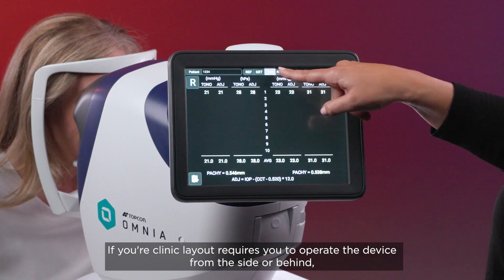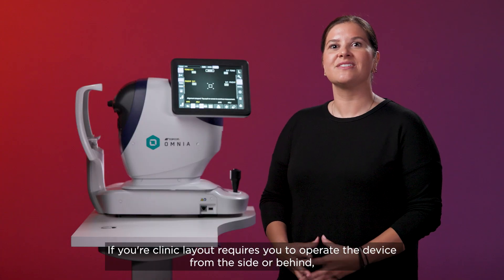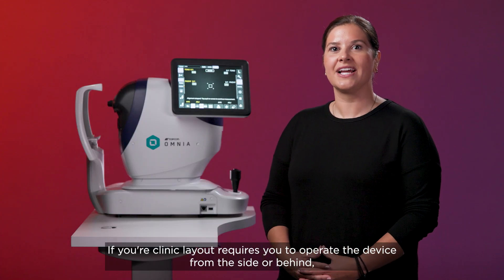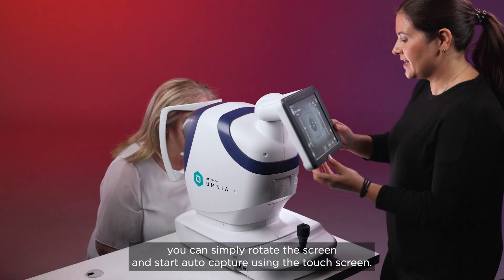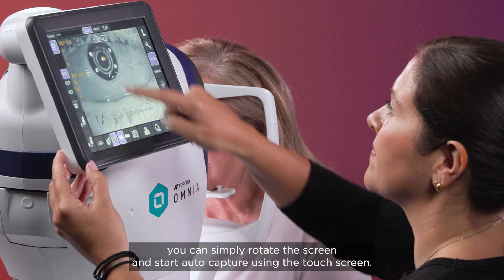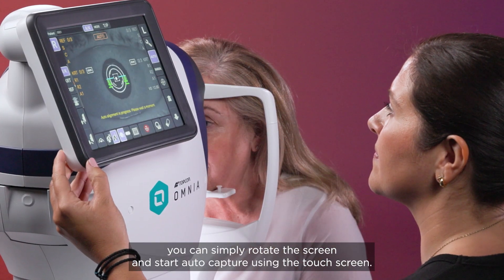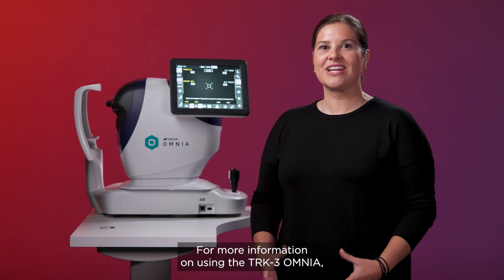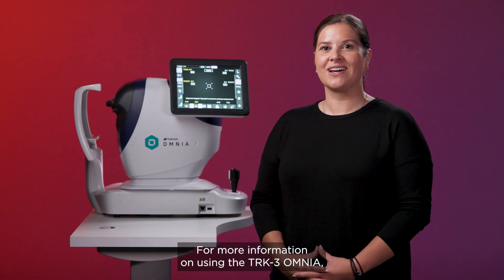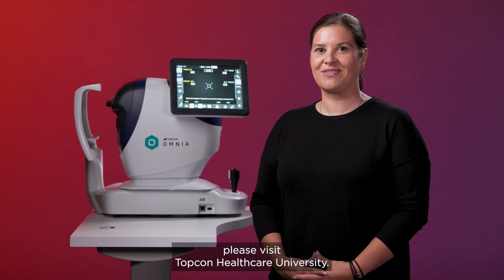If your clinic layout requires you to operate the device from the side or behind, you can simply rotate the screen and start auto capture using the touch screen. For more information on using the TIK3 Omnia, please visit Topcon Healthcare University.